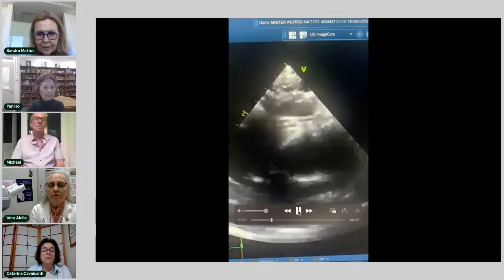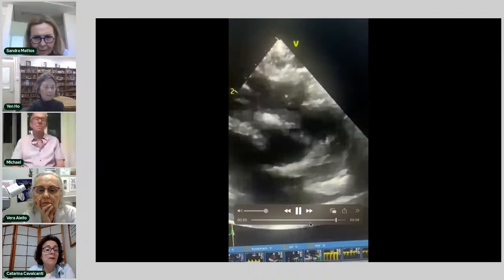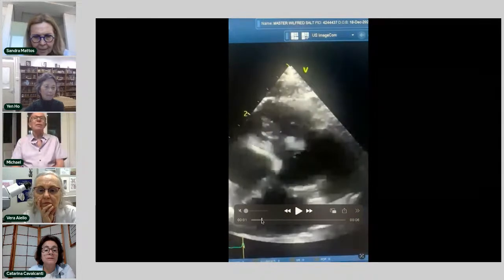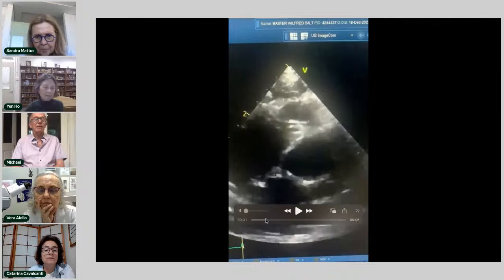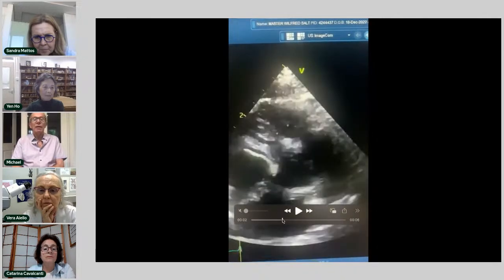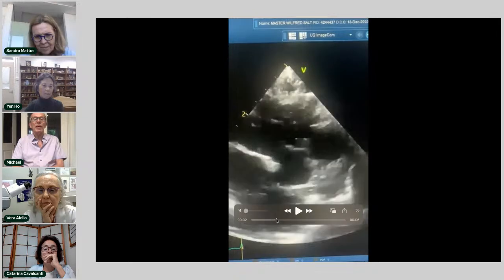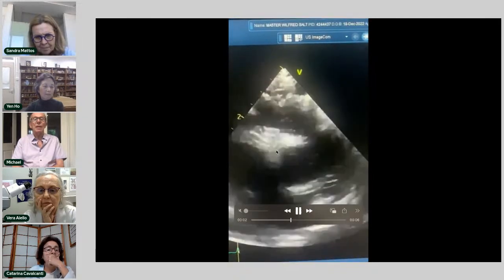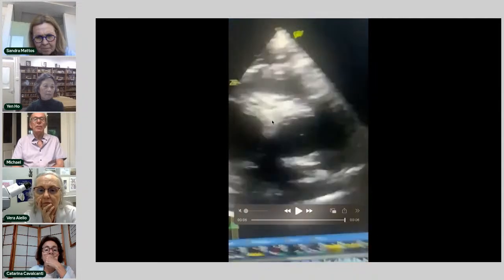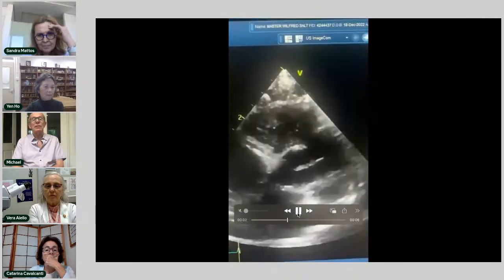You see that? Okay. When you're looking, Helen, at a case in your hospital of tetralogy of Fallot but with pulmonary atresia, so tetralogy type anatomy with pulmonary atresia. Well, there's the anomalous coronary there. You can see the right coronary, quite a big vessel, and then if you play it again, you'll see something going across above the aorta. There it is. That is the LAD going across from almost 9 o'clock to 3 o'clock, across the right ventricular outlet.